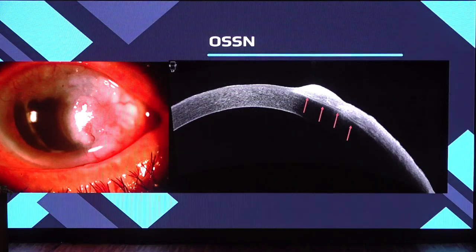On doing a biopsy, we could see keratin pearls and increased mitotic figures suggestive of OSSN. Another feature, like here in this picture also, you can see that in OSSN you typically see increased hyperreflectivity of the epithelium, a thickened epithelium, and there is an abrupt transition between the hyperreflective epithelium and the hyporeflective epithelium of the cornea. So that's very important from our diagnosis point of view to diagnose OSSN.